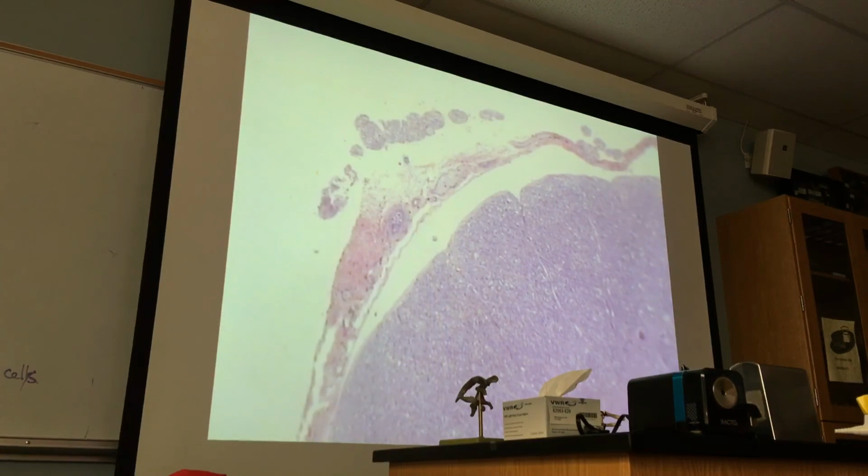Let's do it. This is dura mater. Okay? And this space is the epidural space. If you go farther here, you will hit the bone, the vertebra. Look here, this is arachnoid, or the arachnoid mater. Can you see this space in between dura mater and arachnoid? This is the subdural space.